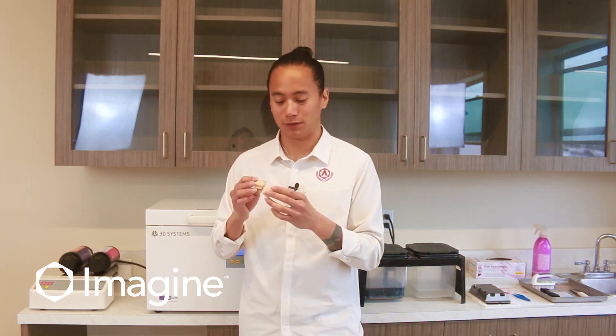Once your models are completely finished, the implant analog has been set, and the gingiva has been placed on your model, the last thing you're going to have to do is glue in your articulator — but after that, you're all set.